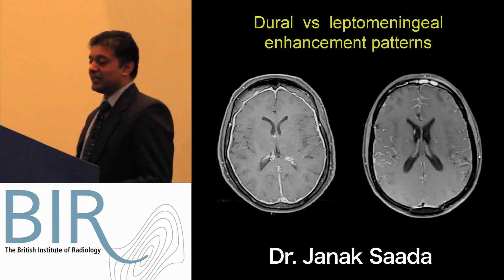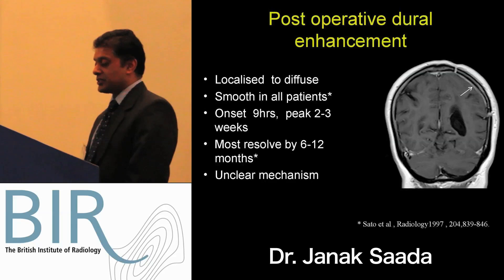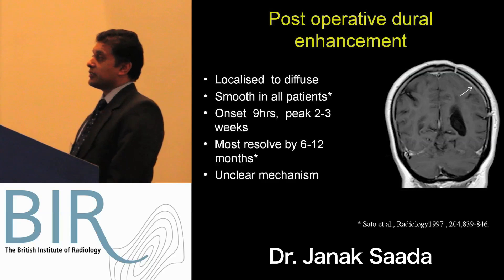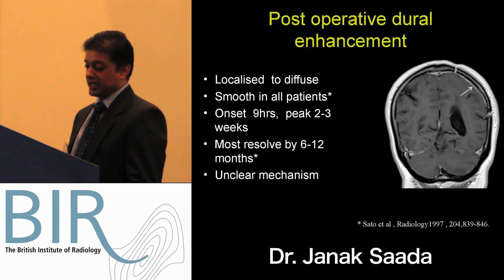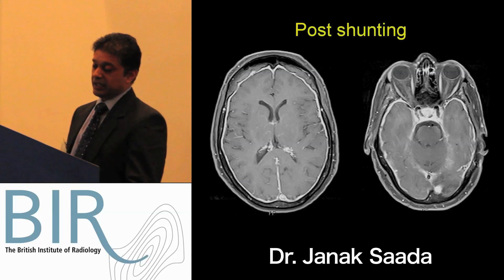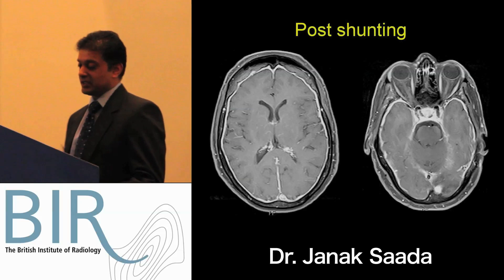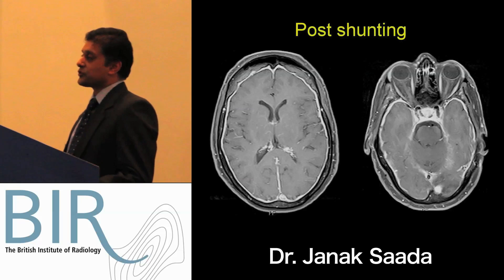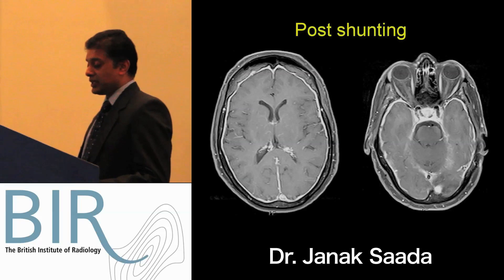Let's look at the dural pattern. What conditions can give you this pattern of enhancement? It can involve both benign and malignant processes. The commonest cause is post-operative change, but other entities such as intracranial hypotension, meningioma, metastasis, and granulomatous diseases can also give this quite extensive but characteristic pattern. This patient has had a parietal craniotomy, and the post-contrast study shows this area of diffuse smooth enhancement just deep to the craniotomy site. It can be more extensive depending on the extent of surgery or the nature of the intervention.